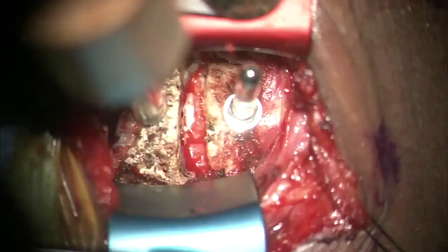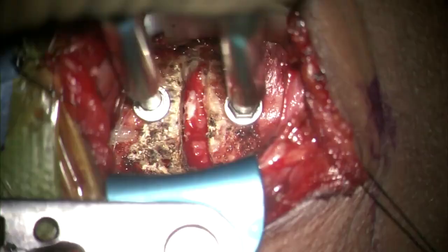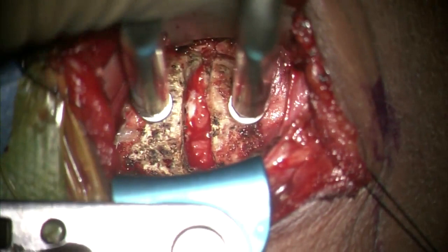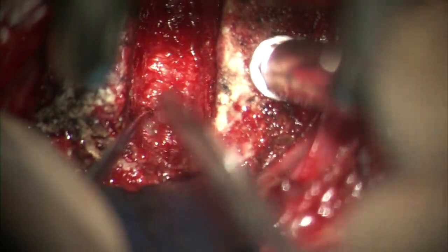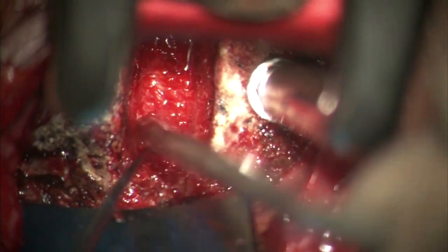The remaining disc material and the posterior annulus are removed, and this helps identify the vertical fibers of the posterior longitudinal ligament. The PLL takedown can be done in the midline, or sometimes a plane can be found on the lateral edge of the PLL, as seen here.